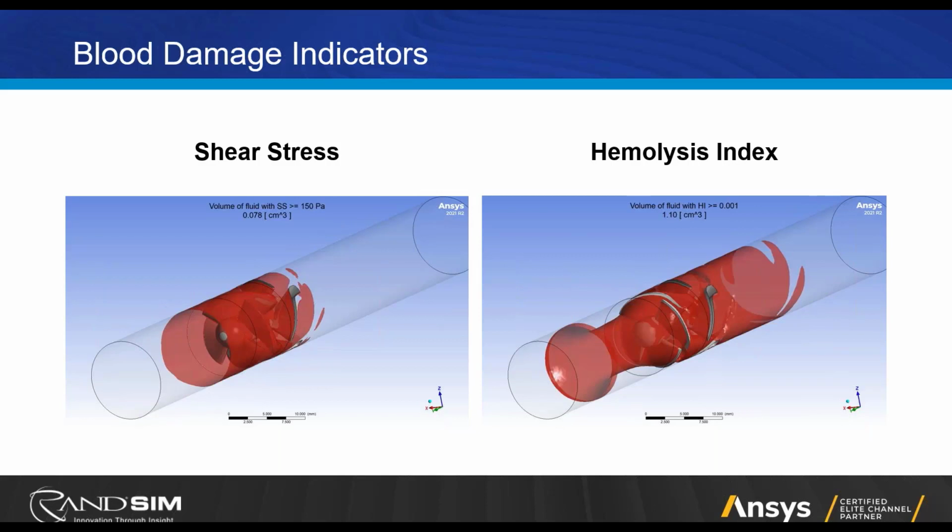Okay, so now what we're showing here is the same data, but in a 3D plot, an iso surface or iso volume. These are regions in the fluid domain, not just on the wall, where you can expect high shear stress and potential for hemolysis. So you can see, looking at just shear stress, the potential area of concern is very small compared to what it looks like when you include the hemolysis model. There's basically an order of magnitude increase in the regions of potential blood damage between these two predictions. And of course, as engineers, we want to be conservative.